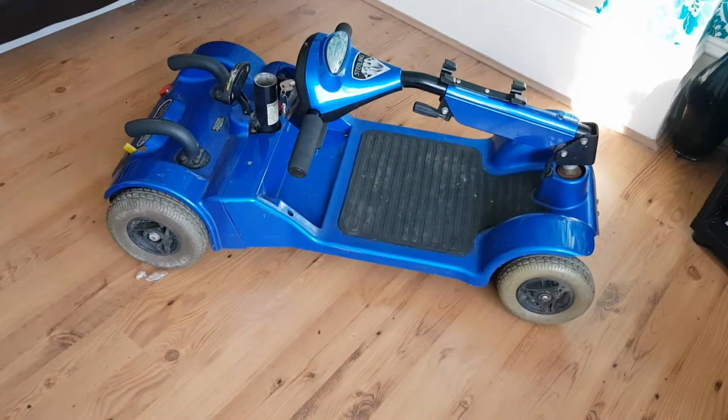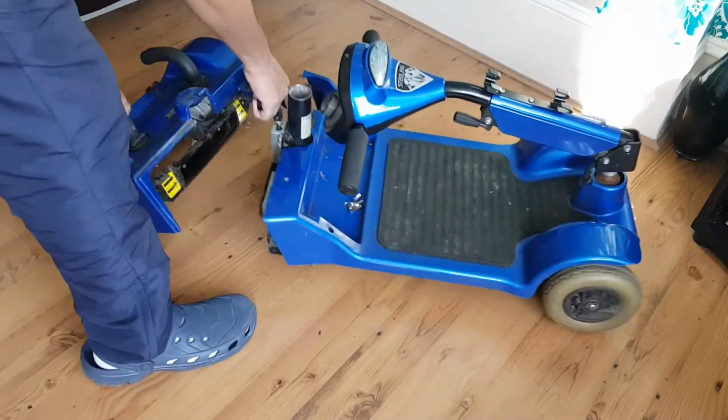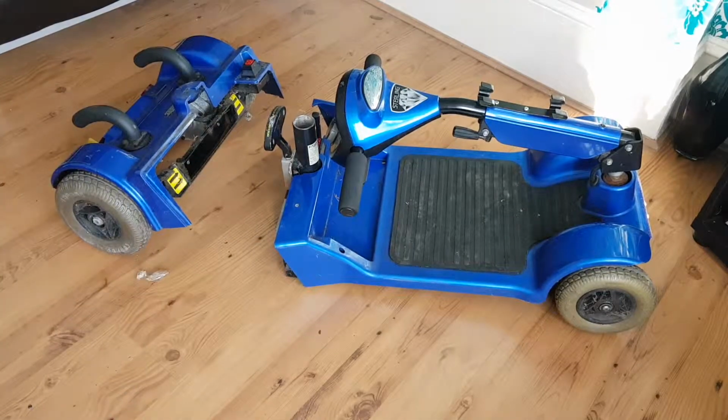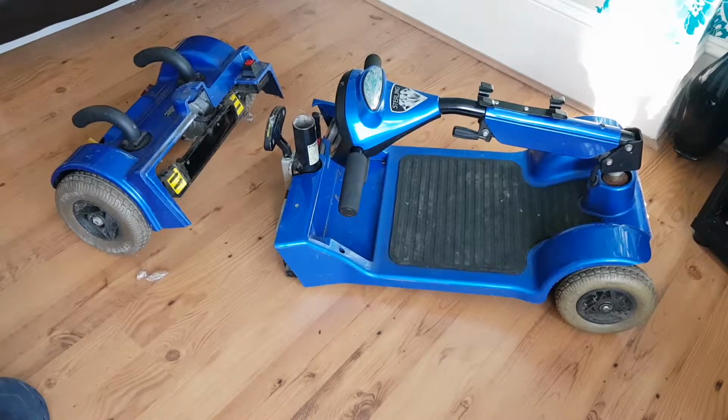And then you can actually disconnect the back, the actual drive area, the drive bit. So there you go. Separated. So easy to transport if you need to move it around, or if something fails in the back, you can get that looked at separately. Obviously the battery's here as well.